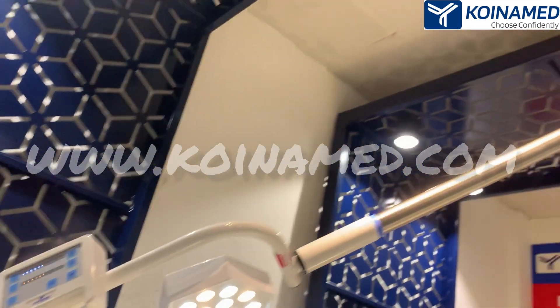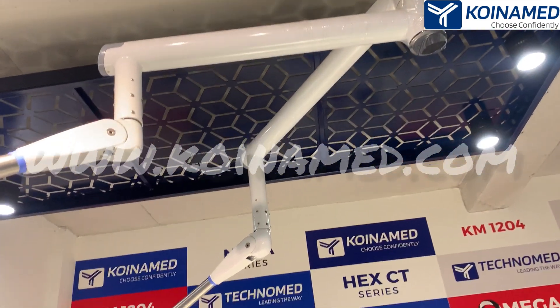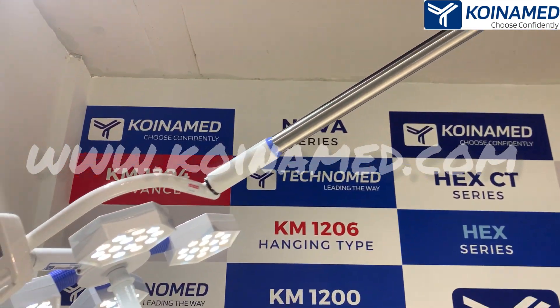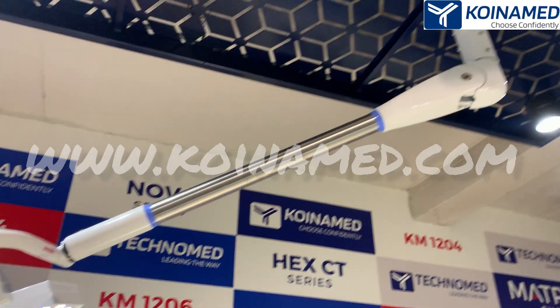The body of the light is made up of high quality fire resistant polymer. The arm of the light is made up of 304 stainless steel. In the above side we have provided the powder coated arms.